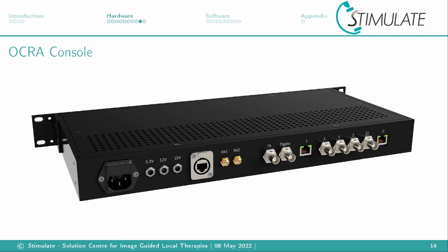We have transmit pulses, receive signal, we have the TX gate, which switches between transmit and receive mode, and the four gradient channels. The console also provides power for the magnet transmit-receive switch and RF amplifier.